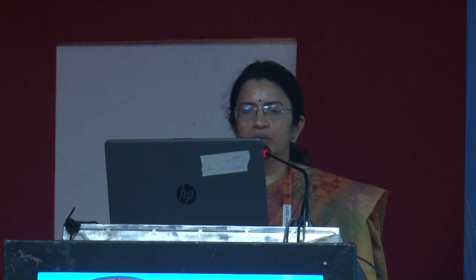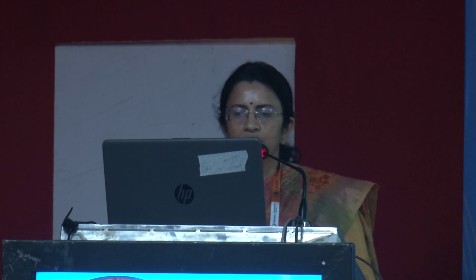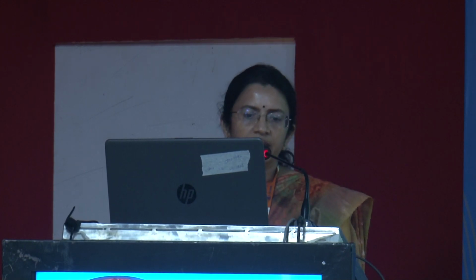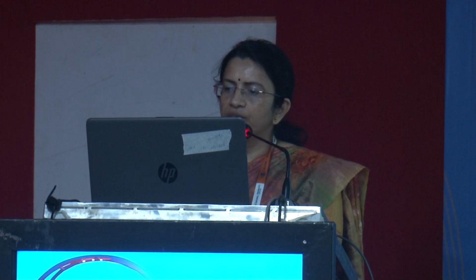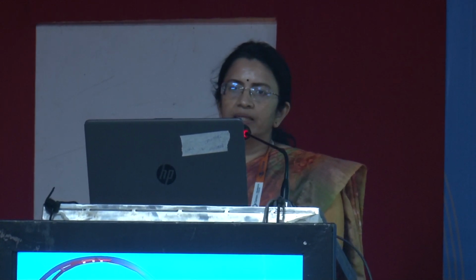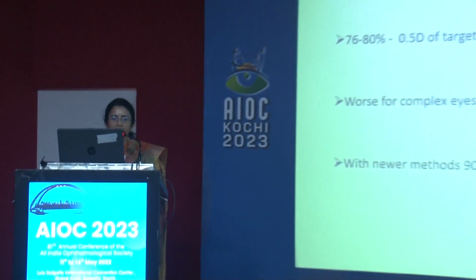Good morning to all. Now, optimizing cataract surgery outcome through biometry, a practical approach. Dr. Warren Hill, in his data entry from more than 260,000 eyes, has shown that only 1% of surgeons achieved an accuracy of a target refraction of within 0.5 diopter in 92% of eyes, and the majority of surgeons attained this in around 78% of cases only.